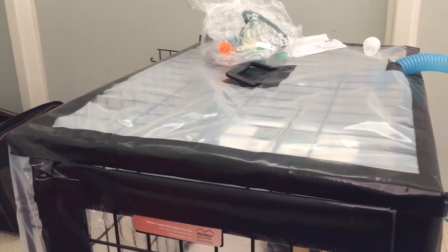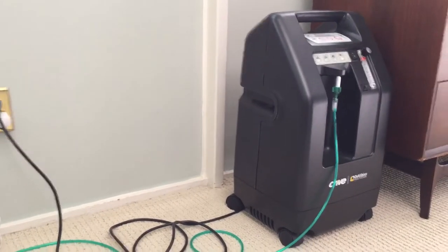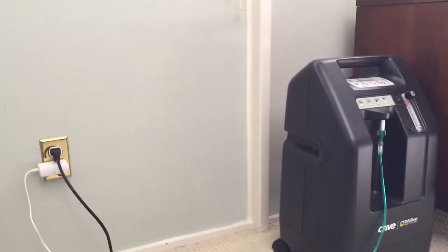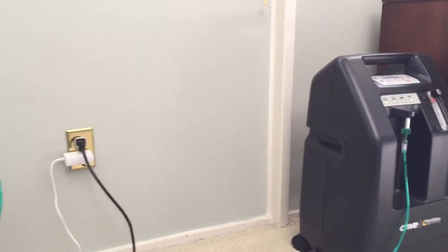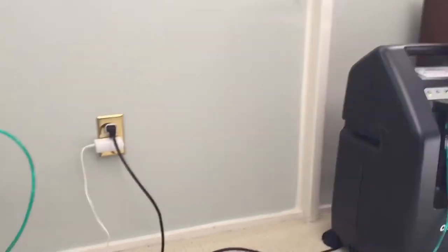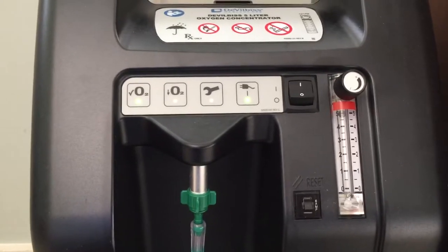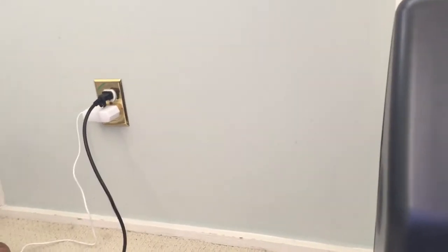2000 ppm is still like being in an office building or a party where CO2 gets a little higher than optimal. We bought this oxygen concentrator on Facebook Marketplace for a couple hundred dollars — somebody had purchased it for a family member who never used it. You can buy them used; just make sure they work functionally, are clean, have fresh tubing, and have no leaks. I keep mine set as high as it'll go at five liters per minute to push as much air into the Venturi and keep oxygen levels concentrated.